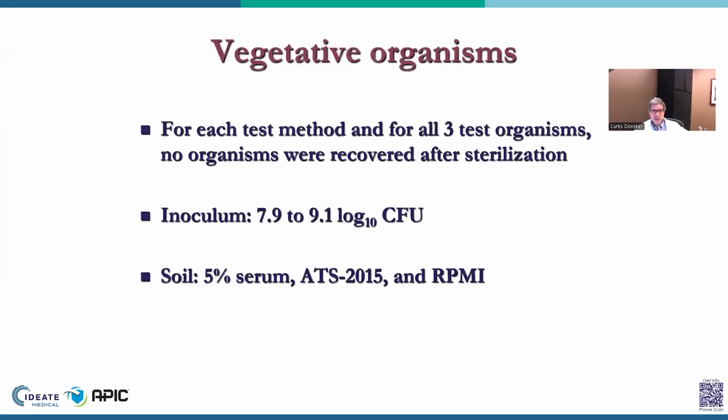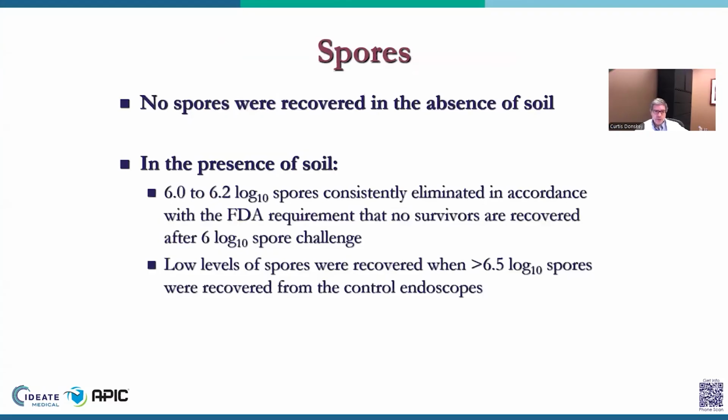So our results. For vegetative organisms, I'm not going to show you any figures because they're all 0. For each test method and for all 3 test organisms, no organisms were recovered. This includes a very high inoculum, up to 9 logs, or 1 billion organisms, of Candida and E. coli. We saw no recovery, and VRE, no recovery of these organisms. And the soil, again, was involved in each of those cases.